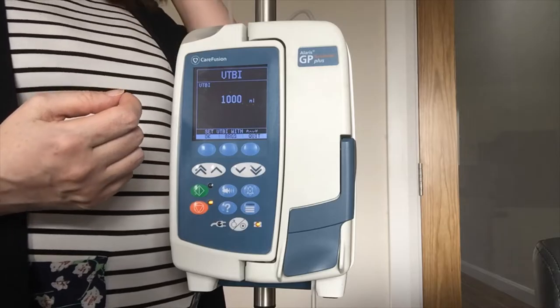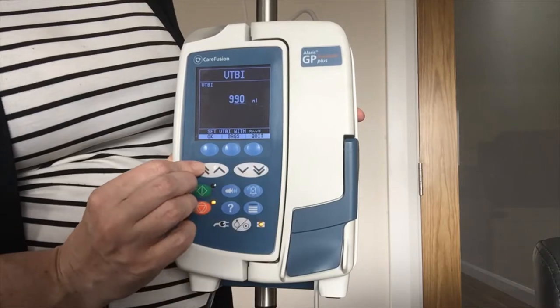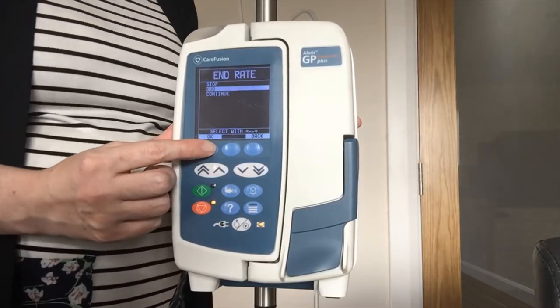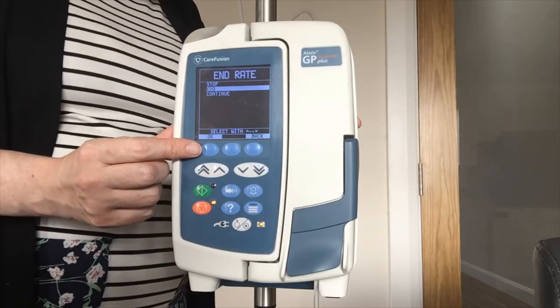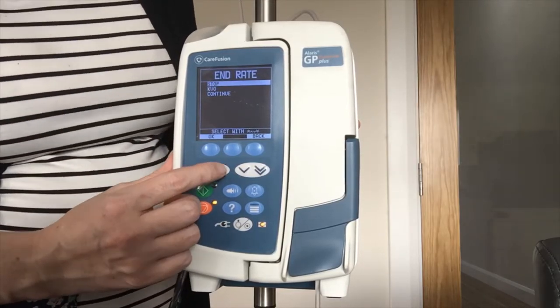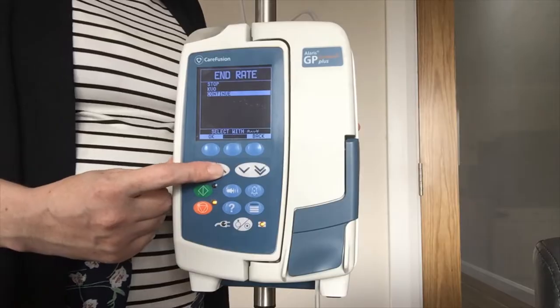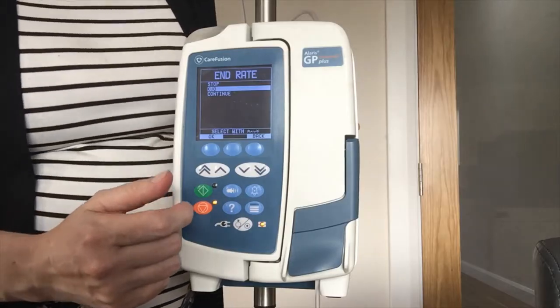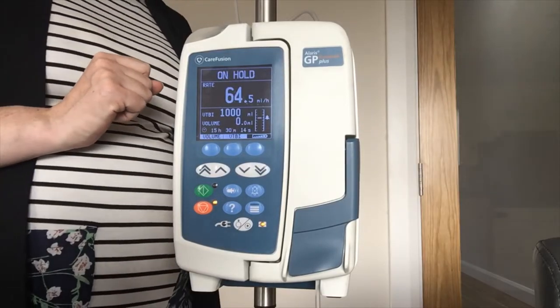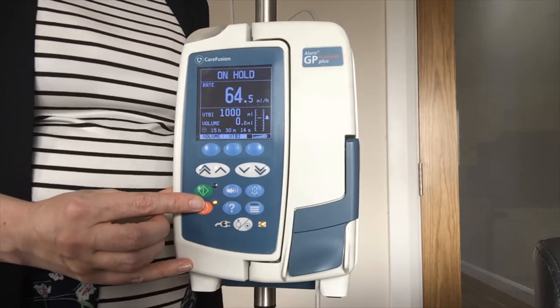It asks you to confirm again, because at this stage if you need to fine-tune — for example to add antibiotics or take your priming volume off — you can use your arrows up and down. If you are happy with 1000 you just leave it on screen and press OK to confirm. It will then ask for your end rate. The default is keep the vein open, but you can also have the pump stop or continue infusing. The end rate is for when your bag is empty — what you want the pump to do. I will leave it on the default, keep the vein open, and press OK to confirm. That is my pump set up and ready to go.